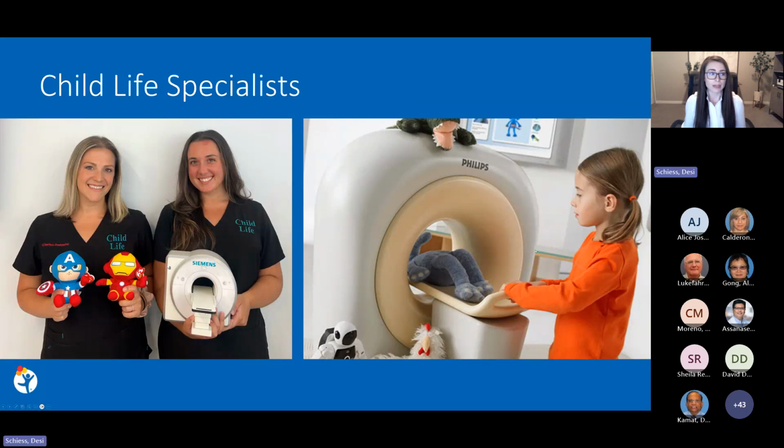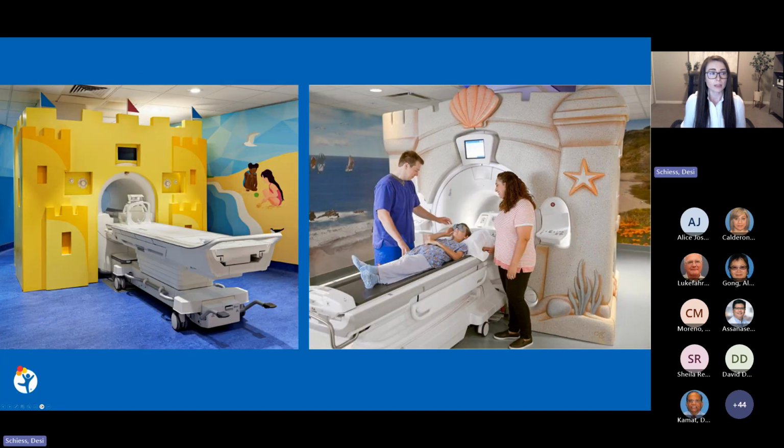Another example of a technique utilized by child life specialists is to prepare children for their imaging exams by engaging in medical play. Many pediatric centers have toy MRI machines such as these, where a patient can place a toy or doll into the machine to simulate what their experience will be like. Last but not least, at a pediatric center, there's a good chance that the CT or MRI scanner might look like this, which is a lot more fun for kids.